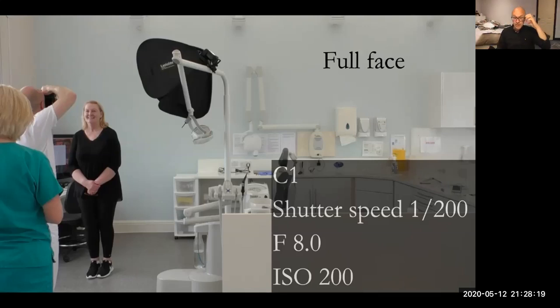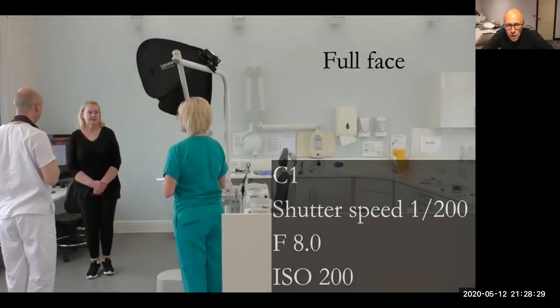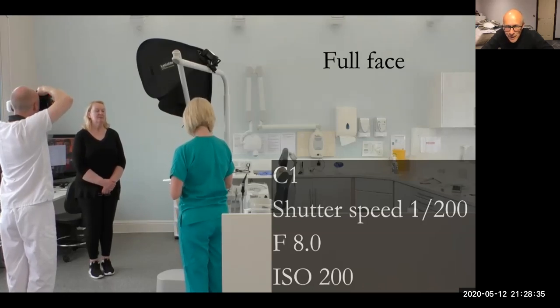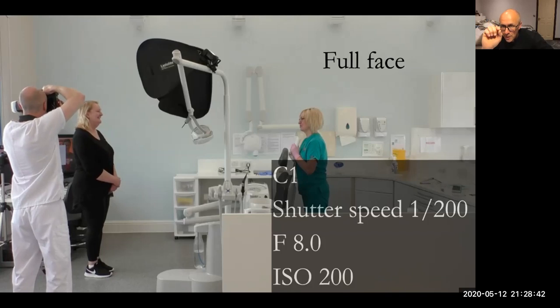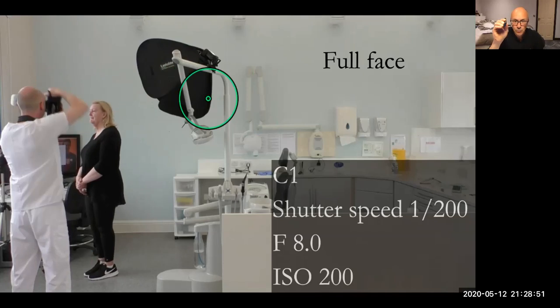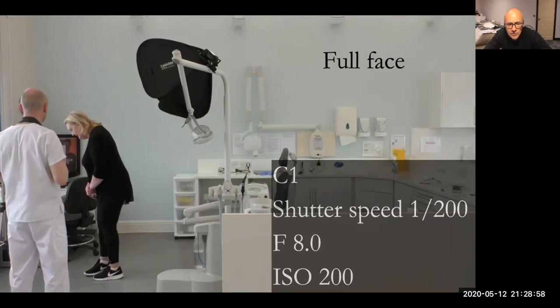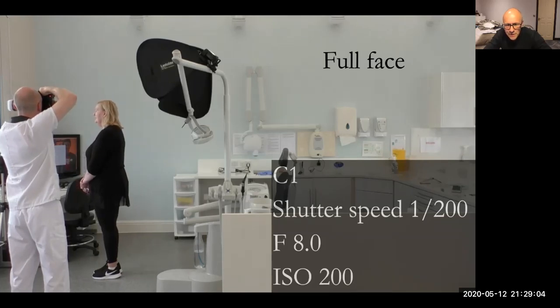This is my extra oral, or my full face approach. So if you watch now, I've got a mark on the floor, and the patient turns to Claire, gives her a smile, and then relaxes the mouth. Look, I've got two flashes. I've got one on the camera and one in that umbrella that fits onto the light there. I can just take that umbrella off when I'm seeing patients. But this gives us those lovely views, standardized. And then I can audit my cases.